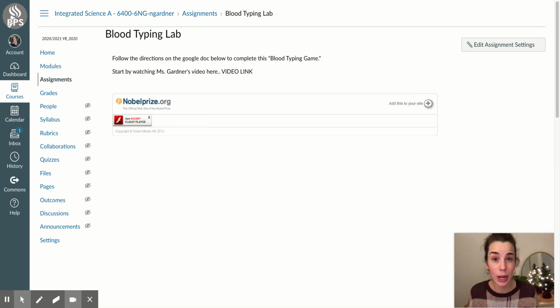So if you haven't already, pause this, go finish those notes and turn them in, and then come back to do this assignment. What you're going to do in this lab is a little game on blood typing.